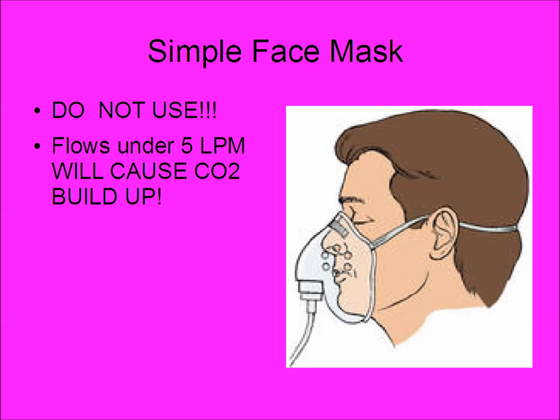Really, in clinical practice, I can't think of a good reason to use a simple face mask. I know sometimes post-op, the recovery room will just throw one on a patient, and as soon as they get to the floor, you just need to put a nasal cannula on them or another device of some sort.